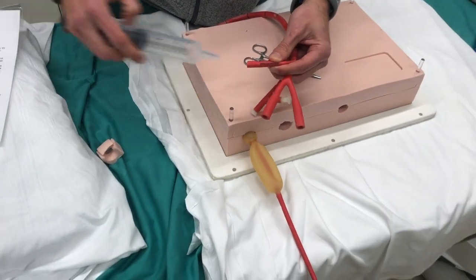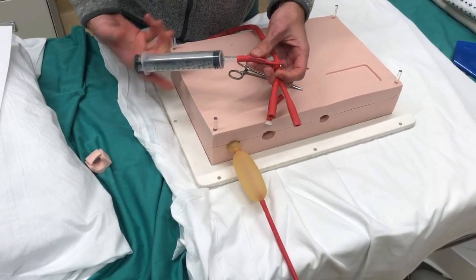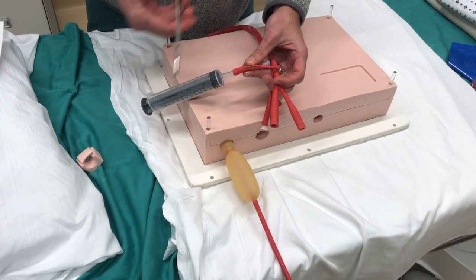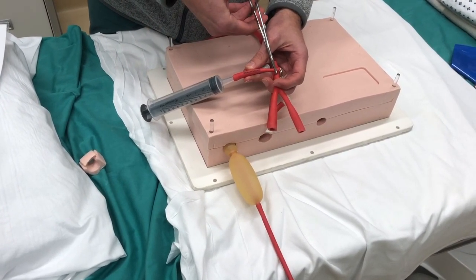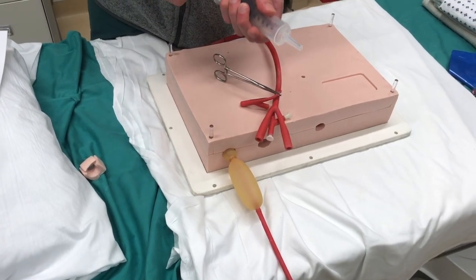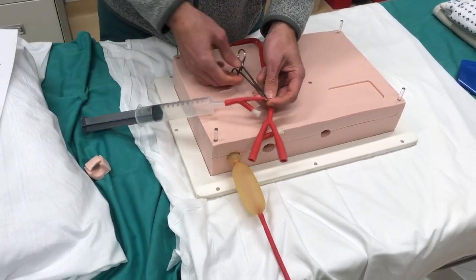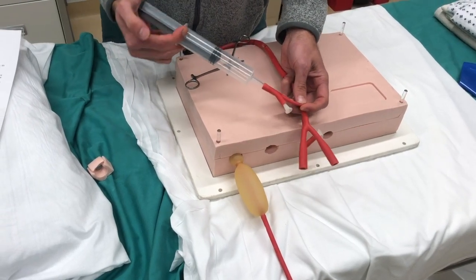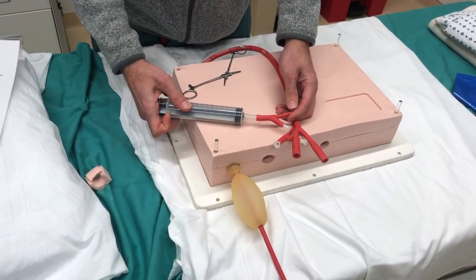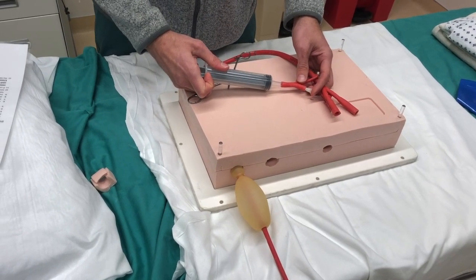Pull out to 50 cc's on your syringe and insert into the port. Inject air into the port and auscultate over the stomach to make sure you hear sounds. At this point, only inject 100 cc's of air — this syringe is about 60 cc's, so between injections of air, remember to Kelly clamp the port so that when you release the syringe you do not lose air that you've placed. Continue, replace the tube, release the Kelly clamp, and inject air again with auscultation to confirm you are in the stomach. Once you have placed 100 cc's of air into the gastric balloon, call for a stat chest X-ray to confirm the balloon is inflated in the stomach and not in the esophagus.